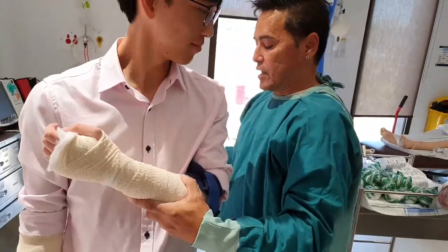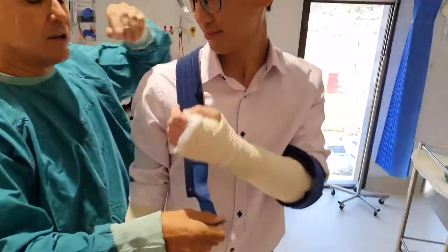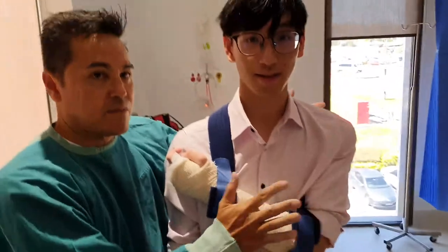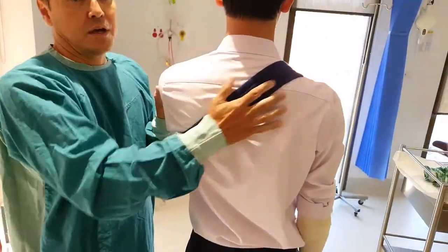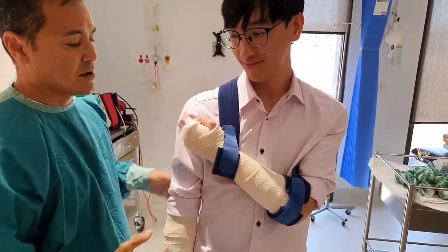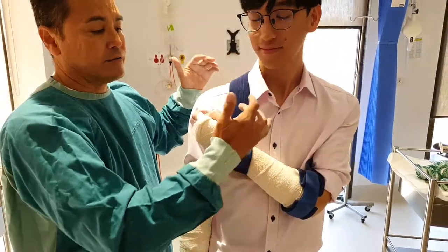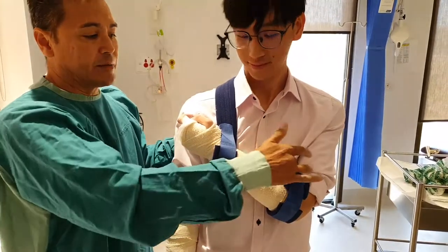What I like to do is go under the arm like this. See how this is going under the arm? The weight is now distributed across here and it's actually a lot more comfortable. I'll get you to drop your arm — the velcro is holding, which is quite good. If you don't have velcro, some products have safety pins or you can use tape.